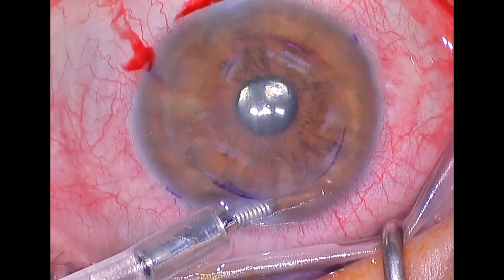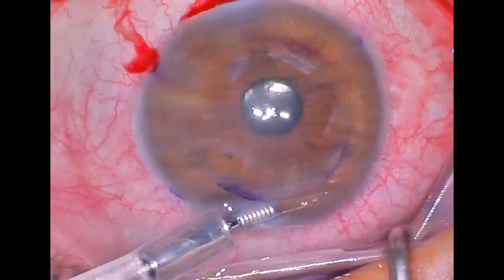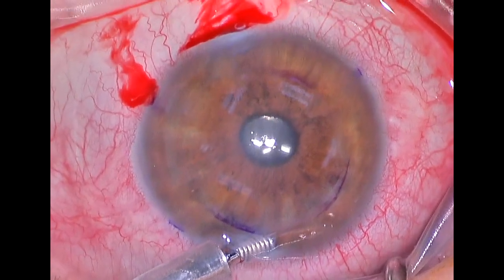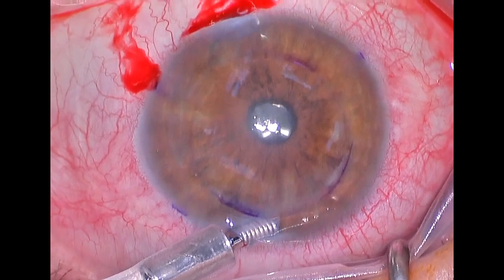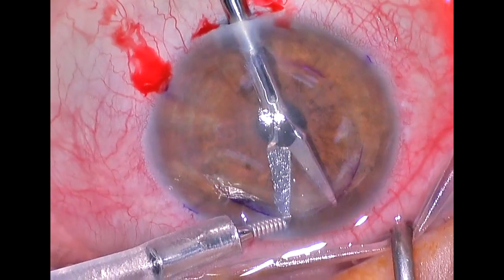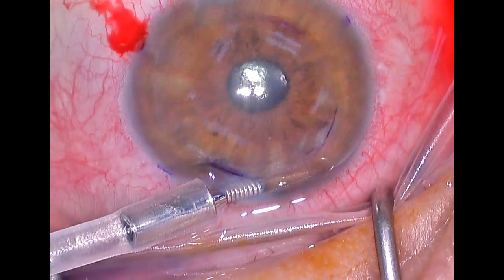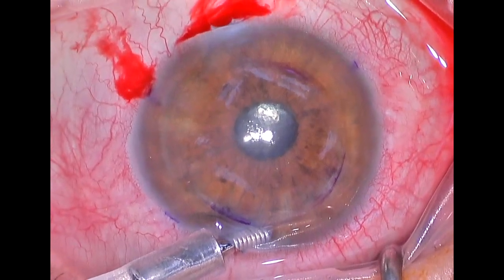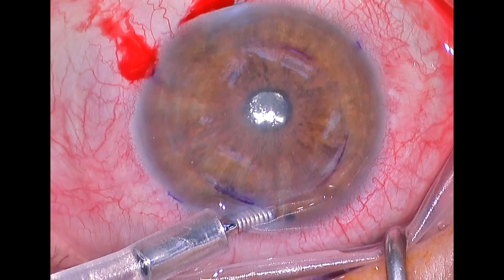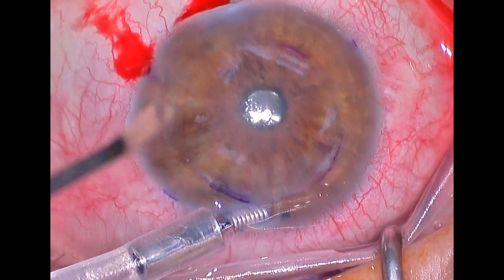The reason that the scroll is smaller and tighter is because the endothelial cells — those internal corneal cells — are much, much healthier than the ones we removed, so the scroll tends to be somewhat tighter. Now we'll first use scissors to create an inferior iridotomy, which is an opening in the iris. That opening is used to ensure that fluid can flow from the posterior part of the eye to the anterior part of the eye. Without that opening, when we place the graft and put an air bubble in the eye, fluid has trouble flowing in its natural direction and the eye pressure can get quite a bit higher.